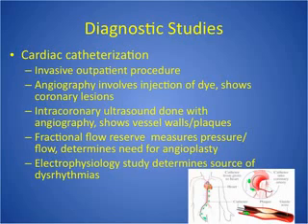It shows structure, it shows pressures, cardiac output, ejection fraction. If they use dye and do an angiography, then they can look at the coronary arteries themselves. It just gives lots and lots of information. Remember, anytime you see the term angiography, they're injecting dye, iodine, into the arteries, so you must ask if they're allergic to iodine. When they do that, it makes the patient feel real flushed, hot, and warm, and then that lets them look for blockages. With the angiography, they can also do an ultrasound there and look deeper into the heart.